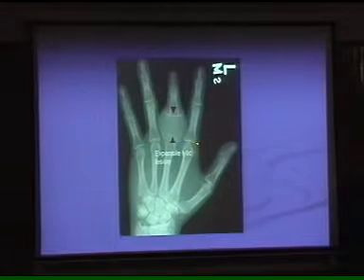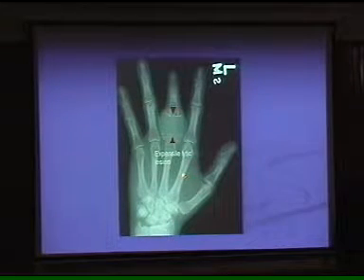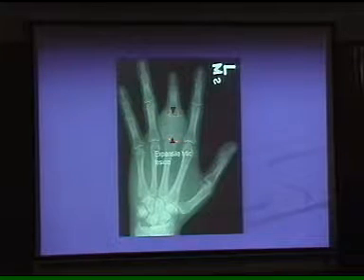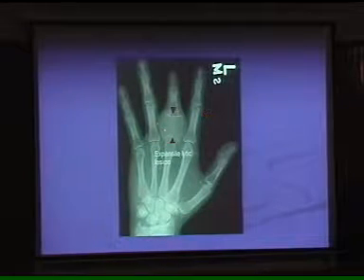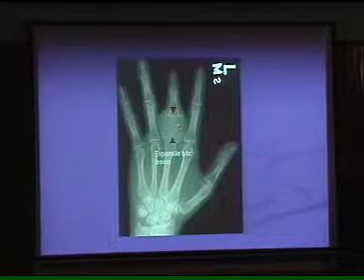leftover bone tissue. Look at this hand of the patient, very nicely outlined cortex. If you look at this joint, beautifully preserved, this joint and this joint. But what you appreciate here is a large expansile lytic area involving the entire bone. Because of the excessive growth, it can go on to the soft tissues as well.